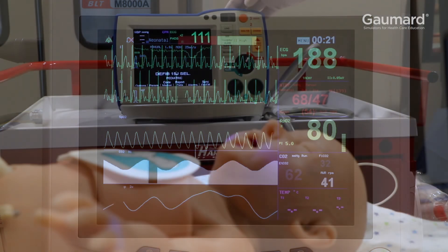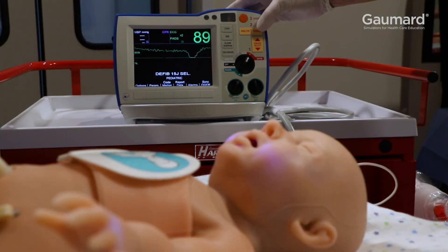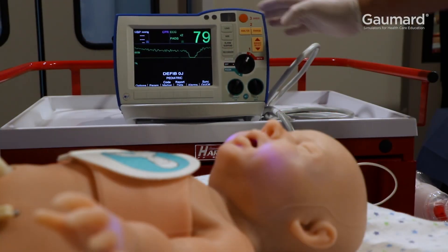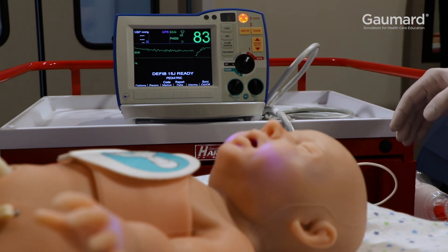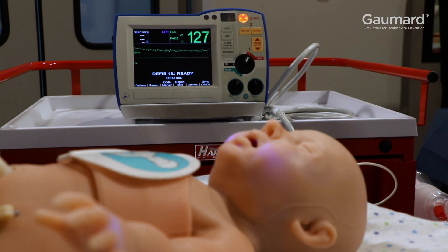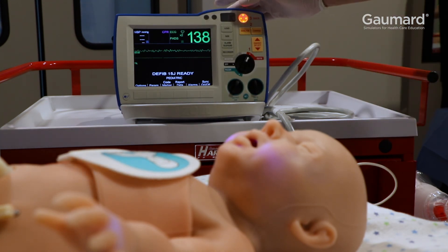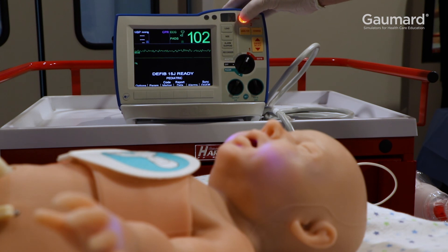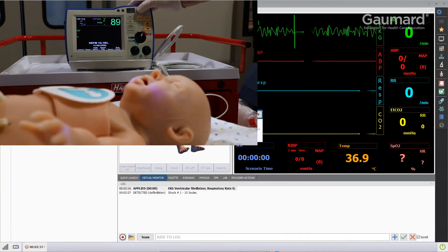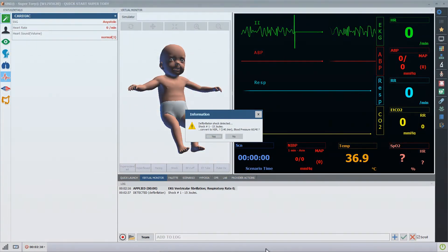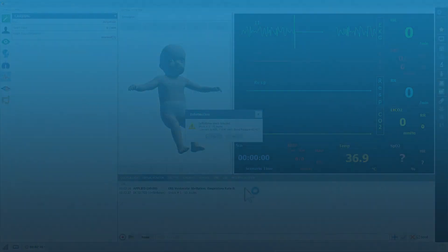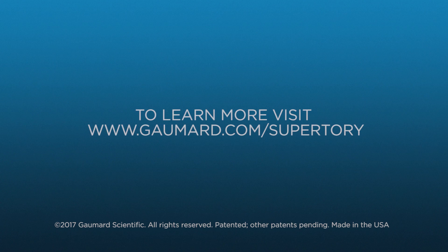For more information about defibrillating SuperTory, watch the video on CPR and defibrillation features.